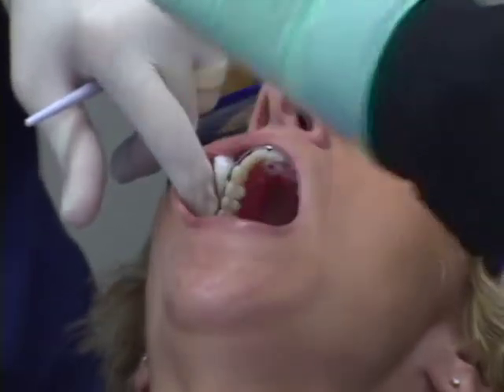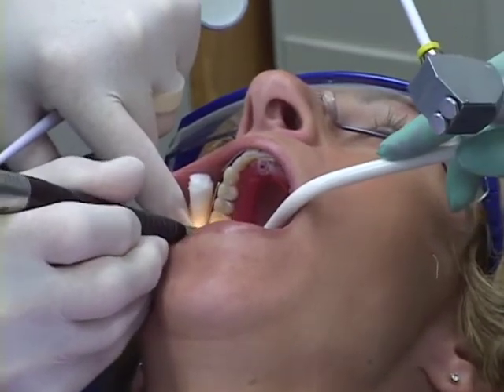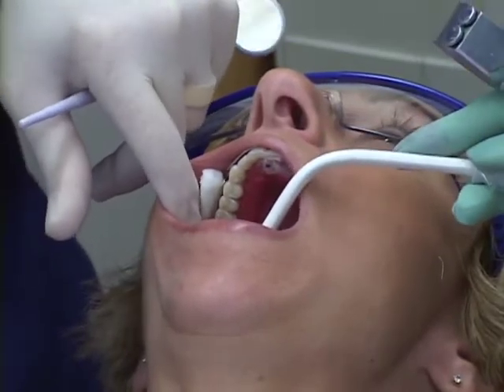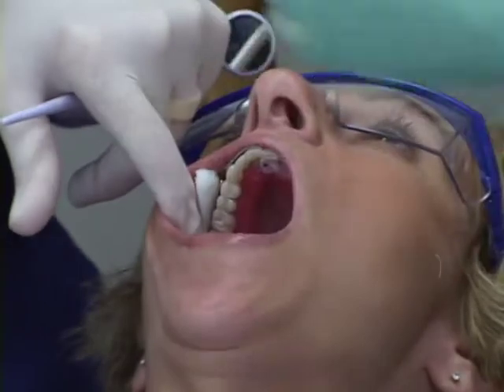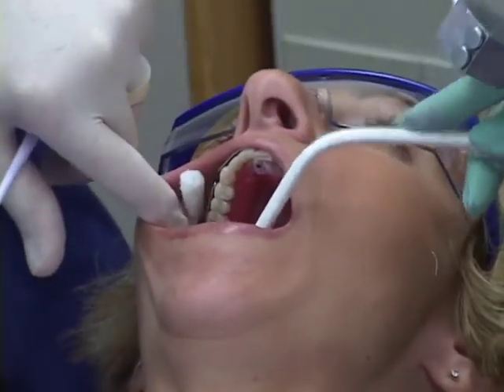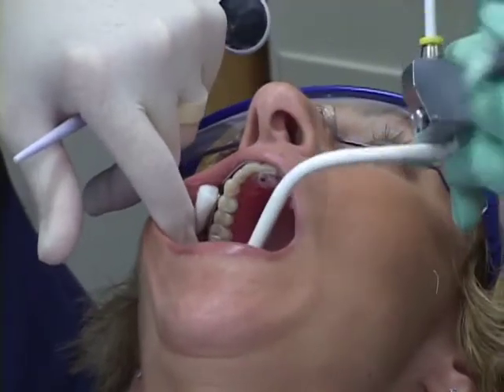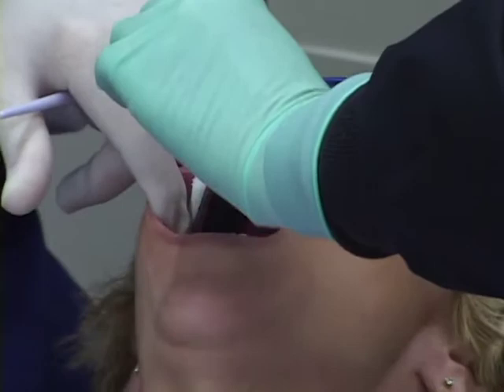Okay? And again, one thing I did mention earlier is always cut dry. Keeping your teeth dry is a real important quality, and if you're using a sharp instrument, cutting dry is much more efficient. Okay.